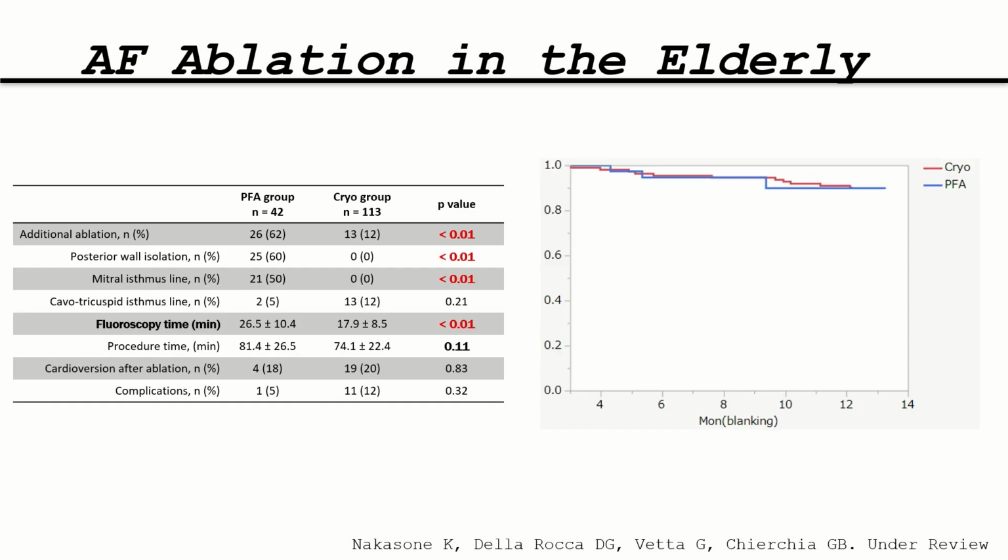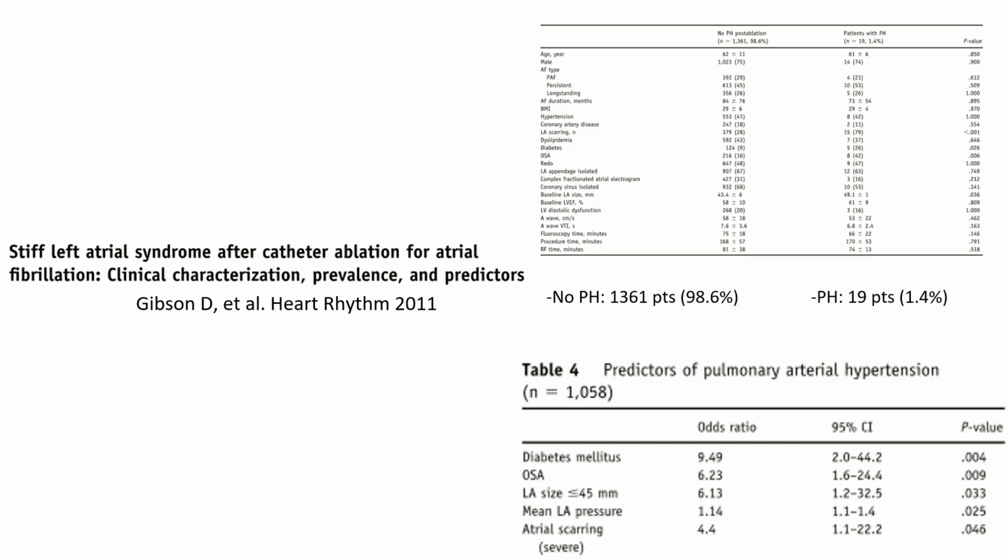But if you look at it, ablating outside of the PVs permitted exactly the same result in these patients. Again, it is a single-center study, so it should be randomized, I do agree, but it does give a hint that with PFA you can probably cure, or at least keep more patients free from recurrence of AF, even with more advanced stages of the disease. We know the stiff left atrial syndrome that has been published with radiofrequency.